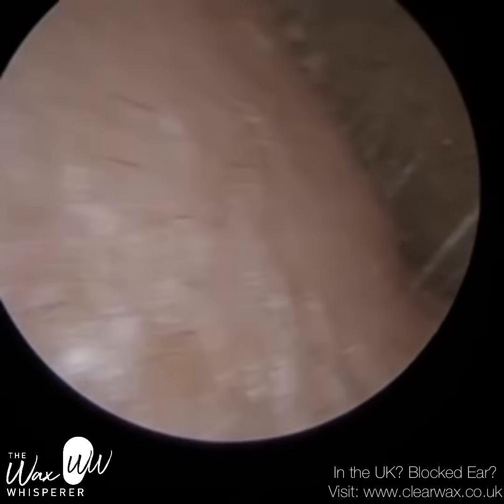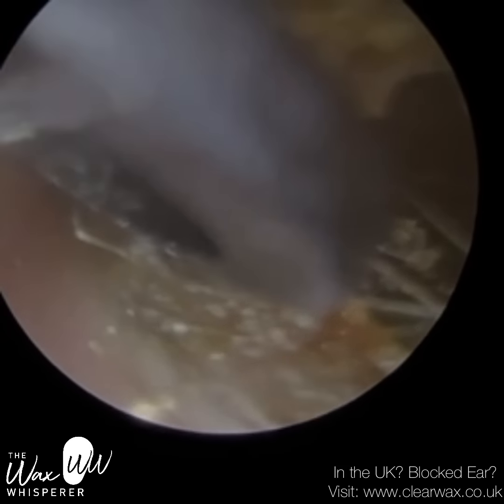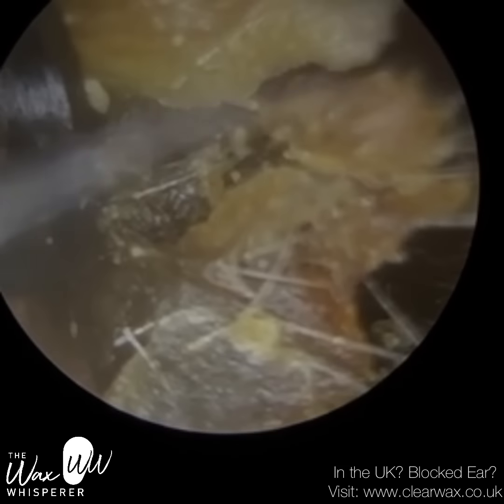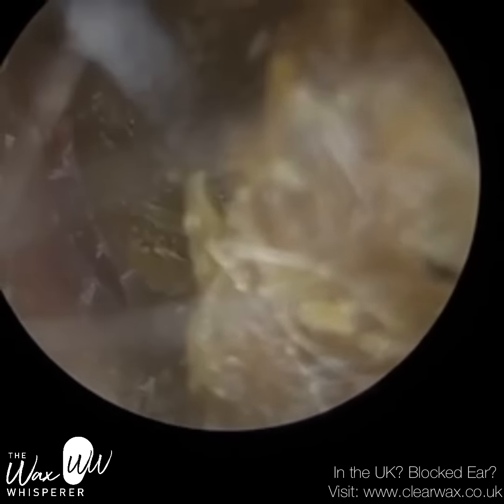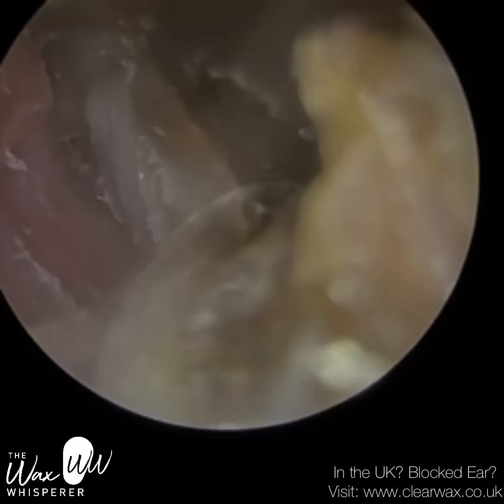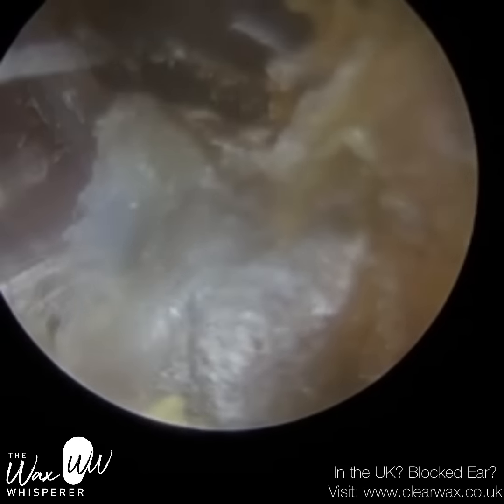But even with the forceps, it's quite tricky removing this. It's really embedded. So I'm just using a Jobson horn now, trying a different angle of attack. I'm going to the back part of the ear canal, the posterior canal wall, trying to get in and behind and lift it away. And you can see I have somewhat separated it there. I'm going to be careful when I insert this Jobson horn, because if I make contact with that canal wall, it's going to be very uncomfortable for the patient.